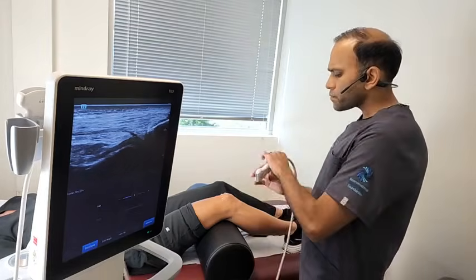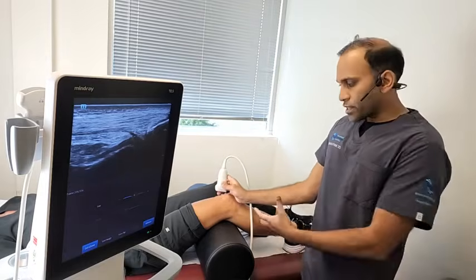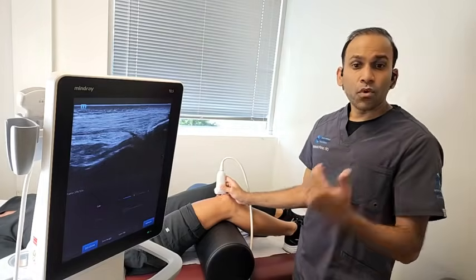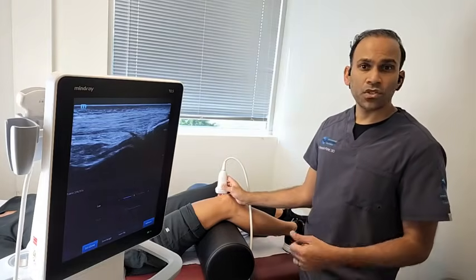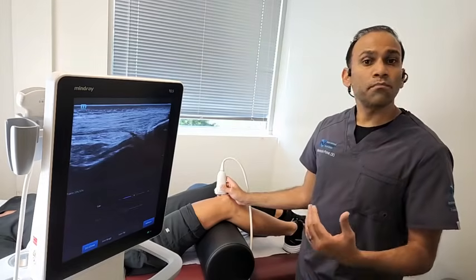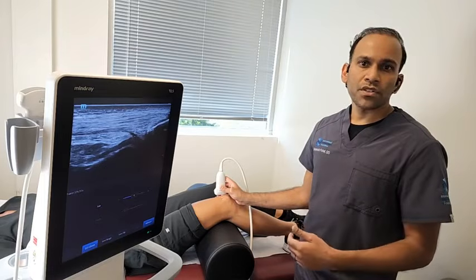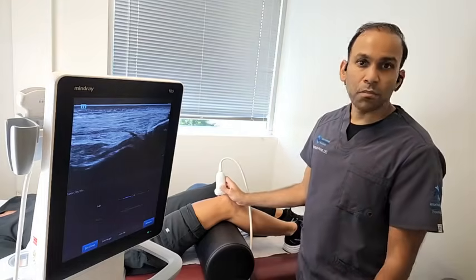So the advantages of ultrasound is that there's no radiation. It's point of care, meaning that I could do this with the patient here and show them live what's going on in their body. It actually is more sensitive than MRI for certain superficial structures like tendons and ligament structures. And we have the advantage of being able to see joints in motion. So we can see what the anatomy looks like when we're moving the knee around in different positions, versus something like an X-ray or an MRI that's a static, single picture.